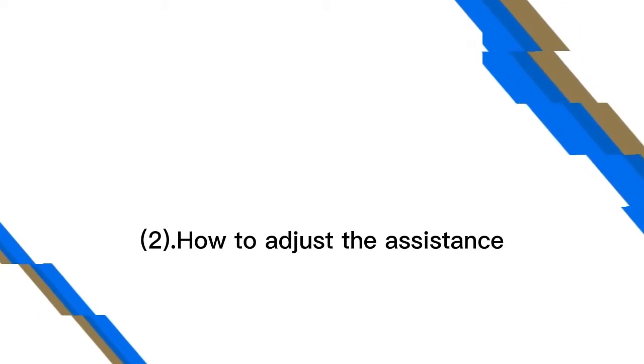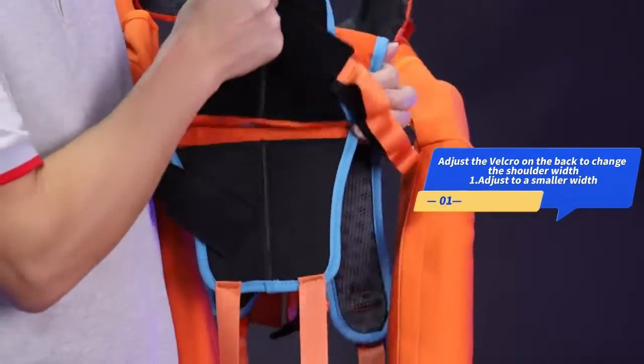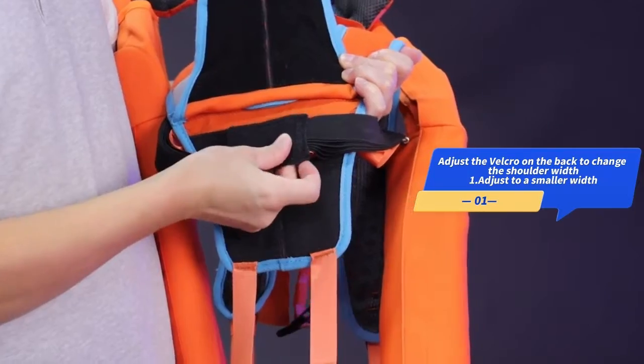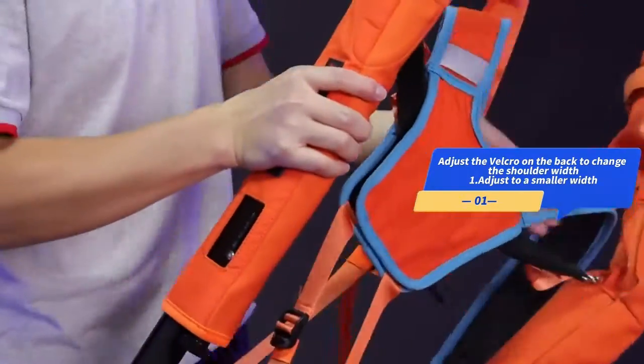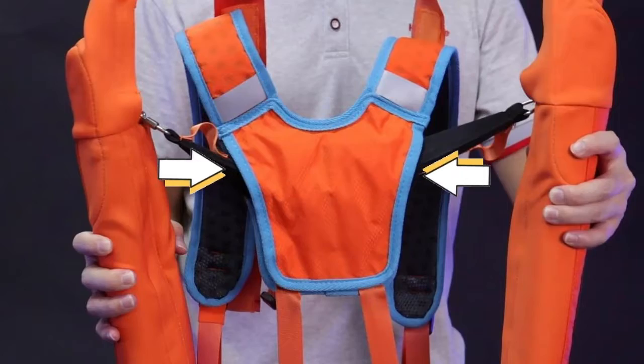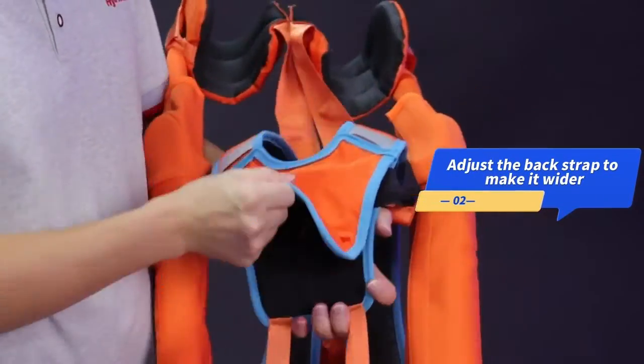How to adjust the assistance. Adjust the Velcro on the back to change the shoulder width — adjust to a smaller width, or adjust the back strap to make it wider.